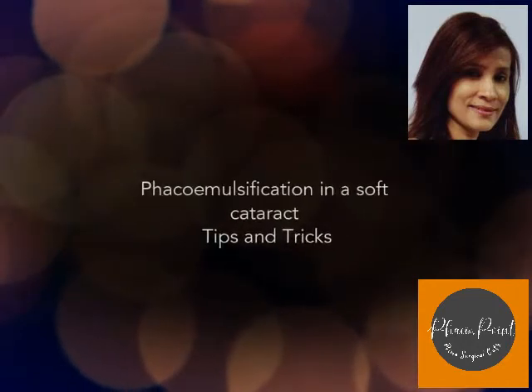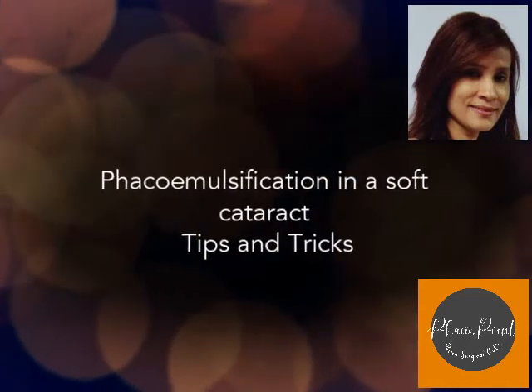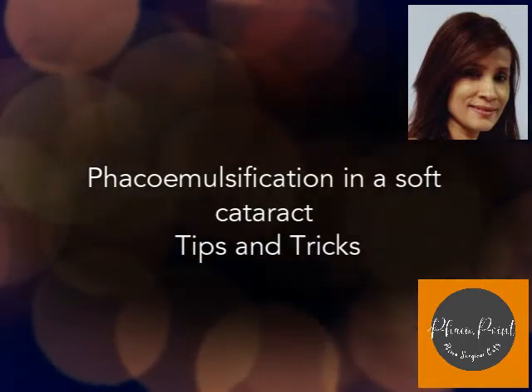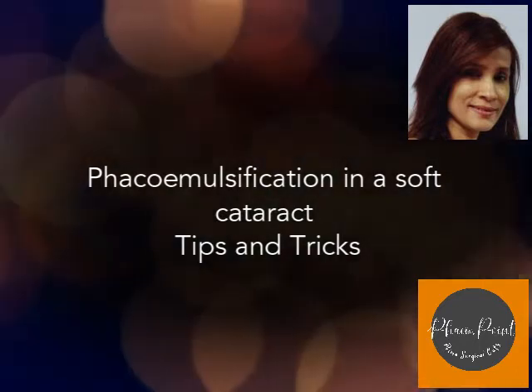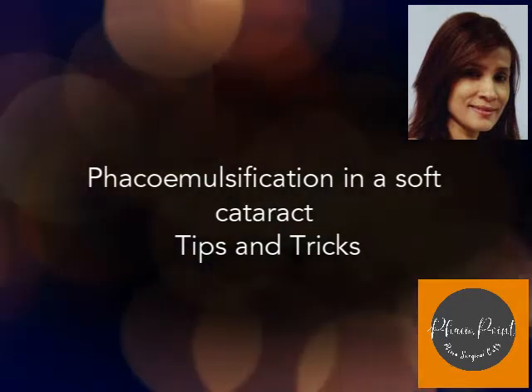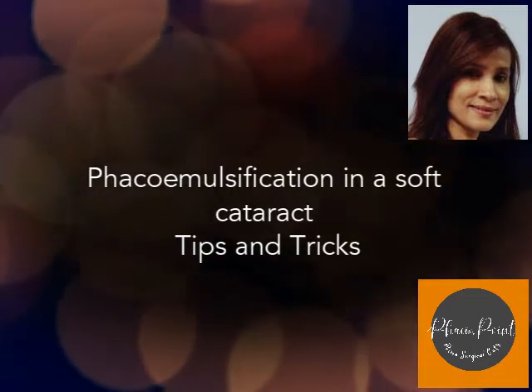Phaco emulsification in a soft cataract comes with its own level of challenges. Because of the soft consistency, the surgeon when he attempts to sculpt — say while performing a stop and chop procedure — will end up getting too deep too soon, which can compromise the posterior capsule.